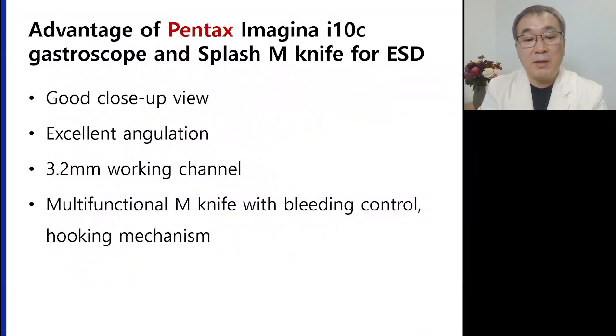Ladies and gentlemen, this is my last slide. The advantages of Pentax Imagina I10C gastroscope and Splash M knife for ESD include good close-up view, excellent angulation, 3.2 working channel, multifunctional Splash M knife with bleeding control and hooking mechanism.